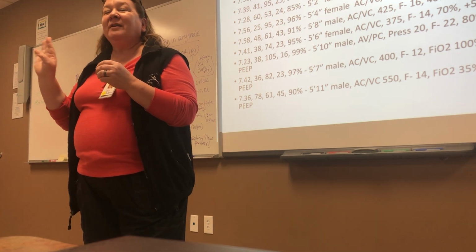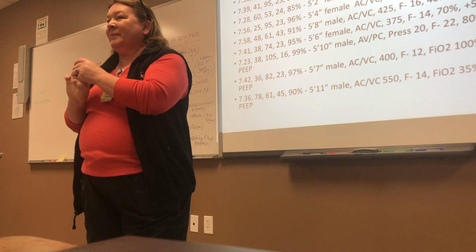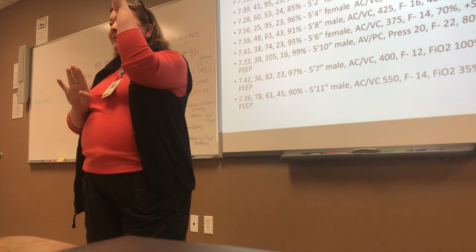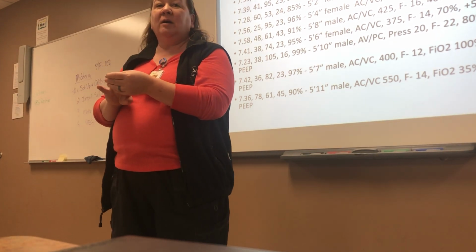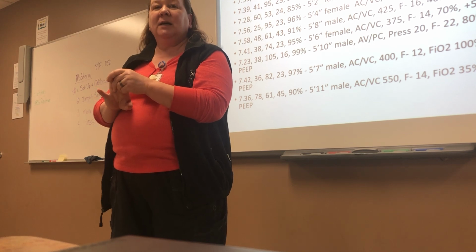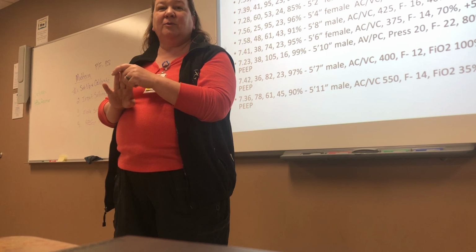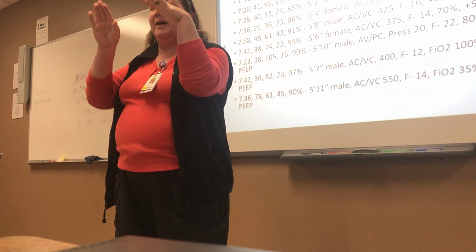If the number that you're setting an alarm for is 3 digits, like tidal volume, it's 100 above and below. 100 above the average, 100 below the average. Has to still stay 3 digits basically. Yeah, so it has to not be below 100. Well, unless you're dealing with a baby and it's different rules anyways. So let's say your tidal volume range is going between 400 and 500.